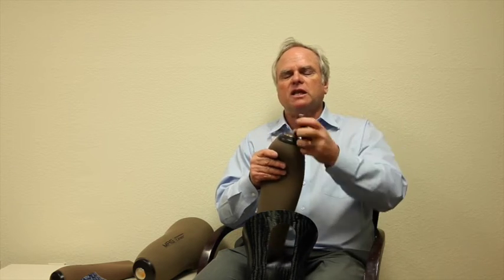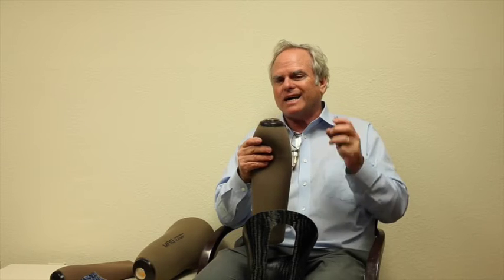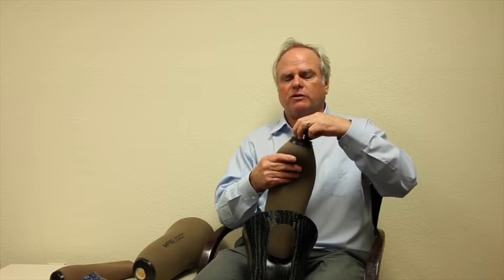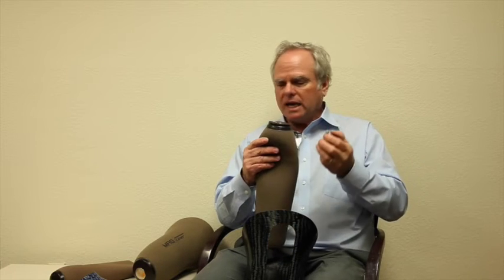If you cast over the liner and come back later and try to get it, you're going to be fudging it. It's not going to be as accurate. Accuracy for the Maglock is important. You can't be a half an inch out of the socket and have this work. You can, however, and I'm going to shoot forward real quick.